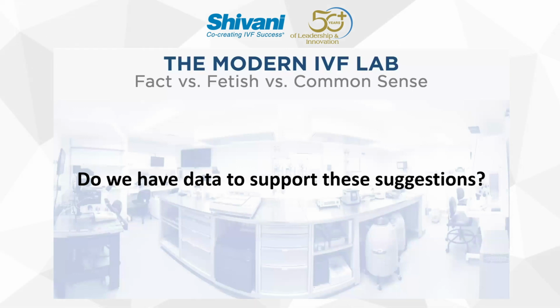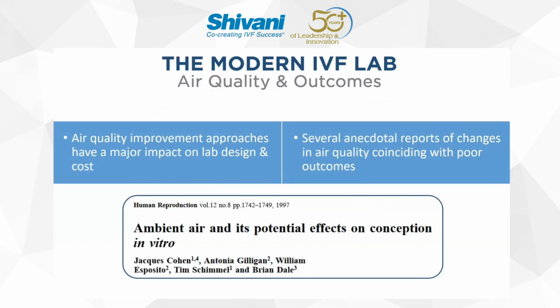So I think most of us would agree that air quality is something we devote a lot of time, energy, and money to. And so I'm often asked, do we have data to support these suggestions? While I don't have any personal data, the nice thing is Jacques Cohen and others certainly have looked at this over the years, and I can present some of their data and let you draw your own conclusions, or at least have background as to why we have arrived at the place that we are currently.